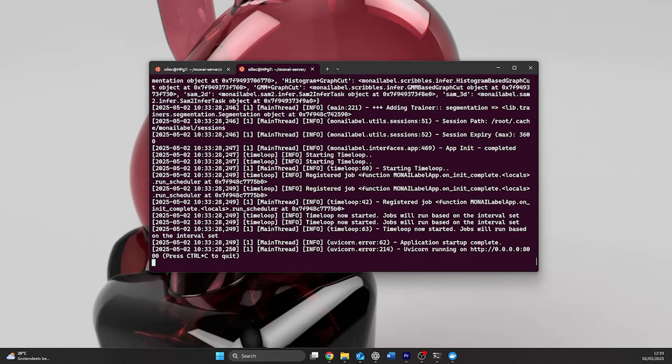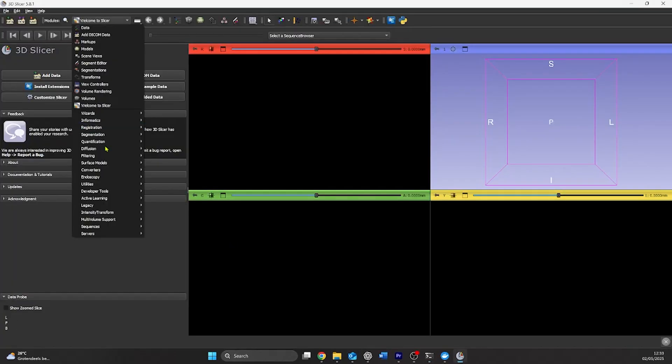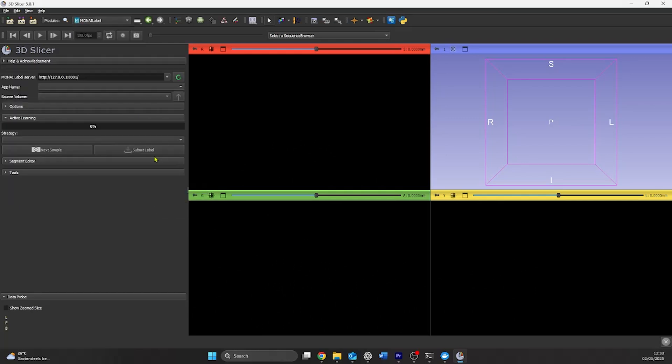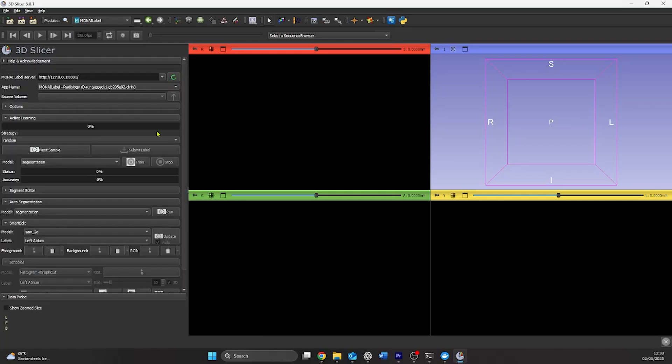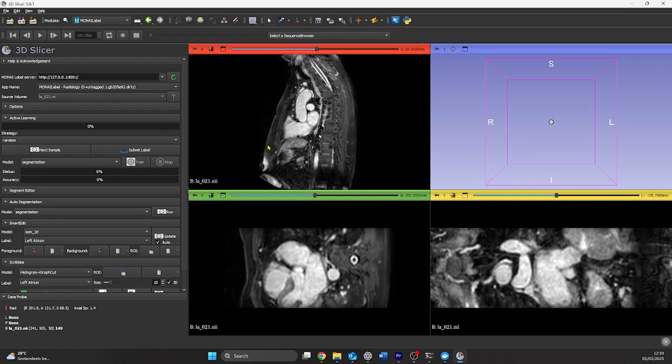In slicer, we need to connect slicer to the server. To do this, we set our Moni label server to the 8001 address as specified in the code I've used to run our server. By pressing next sample, I get the first random sample from our data set.